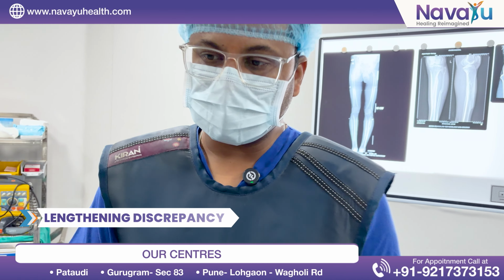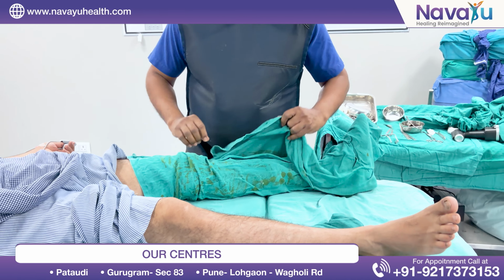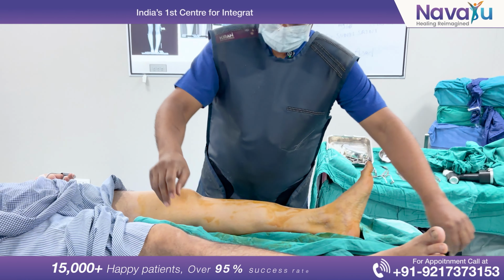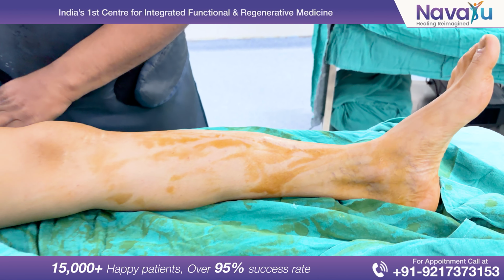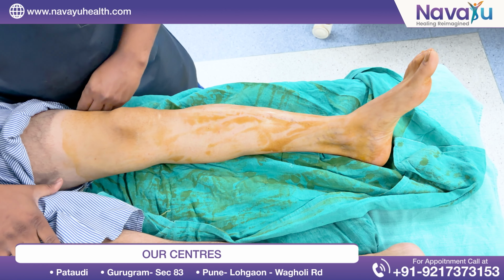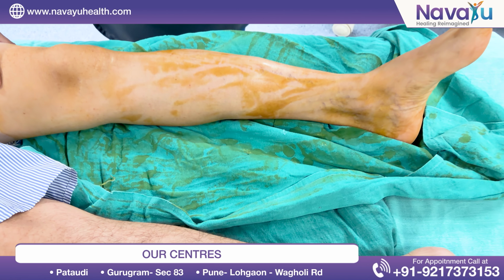Everything is prepared now, and this is his left side and this is the right side. We have already prepared everything, and the scrub has been done. If I feel here, there is a bump, this is because of the malunion, and there is a deformity. If you compare both limbs, there is a varus deformity. We will go for correction. First we will go for fibula osteotomy and then we will correct at the CORA.